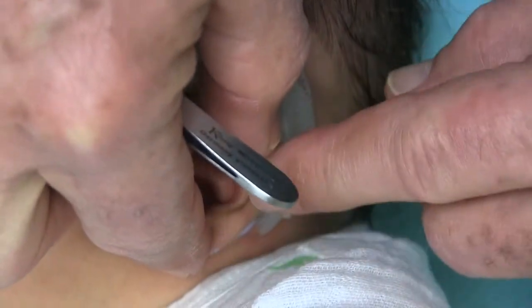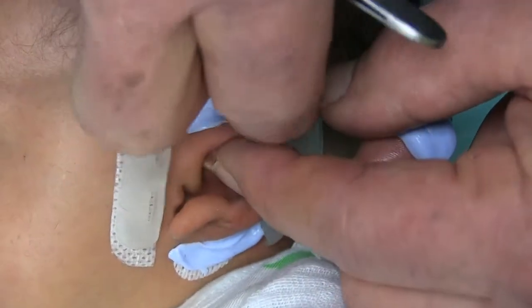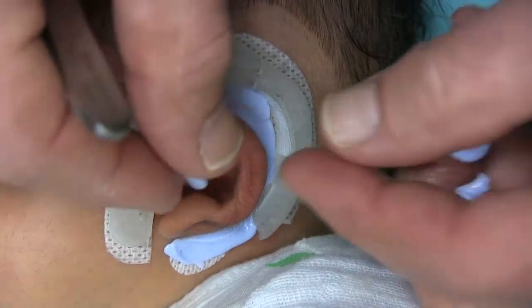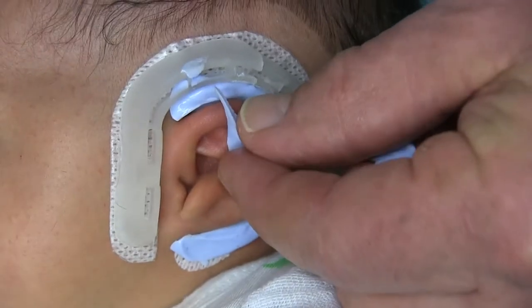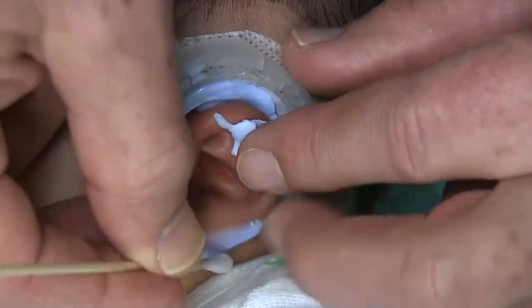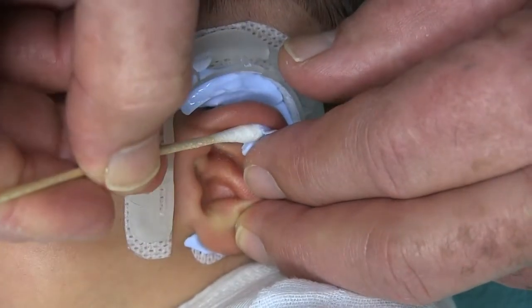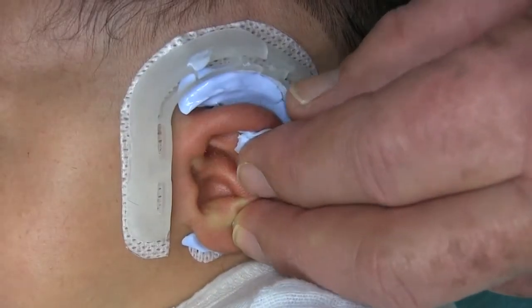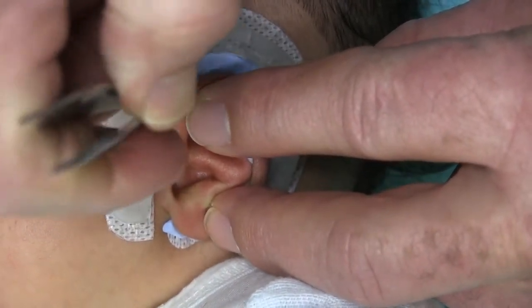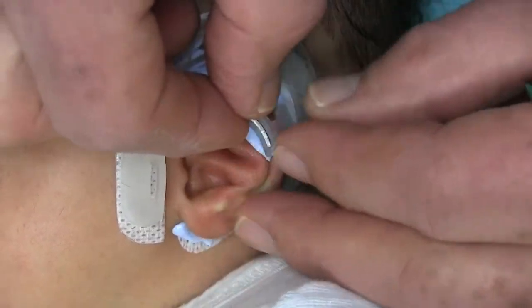He's just like me. I know. He really is. Fight as long as he can. Now I'm going to push this down. It's starting to get firm. Here's the retractor. Don't want to miss an opportunity with that.